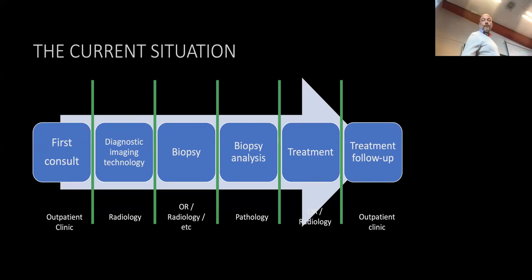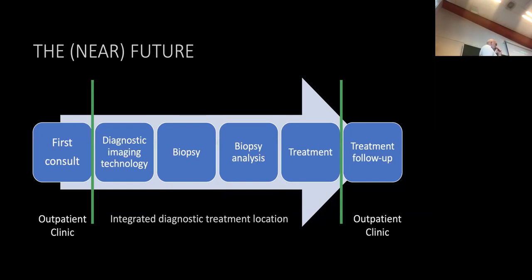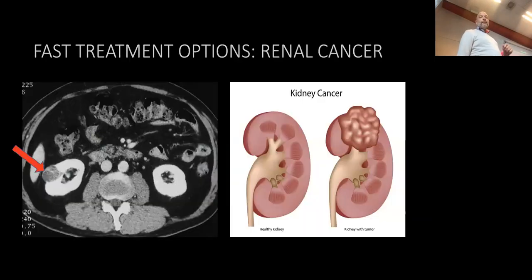So one of the goals that we actually have, and things we really want to do with fast and optical imaging techniques, is see if we can speed this up, preferably in one location in one moment in time, even including the treatment. And I usually like to give an example on that.